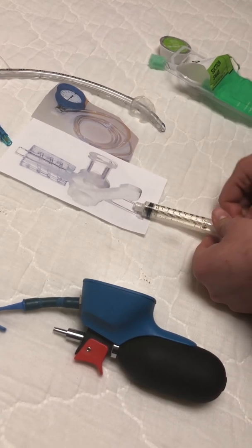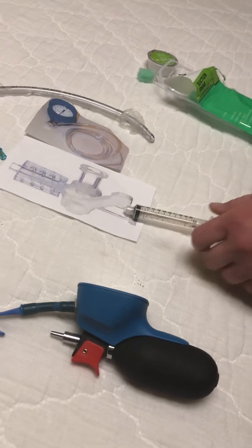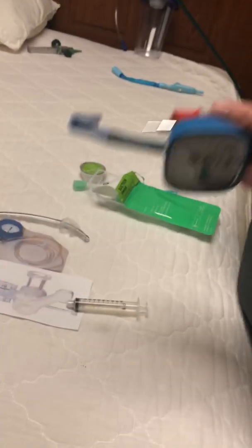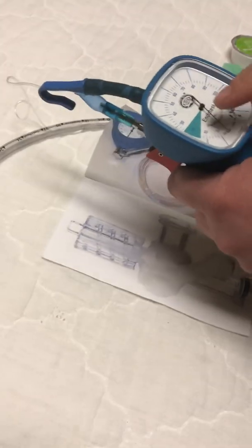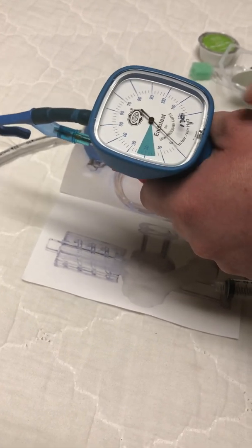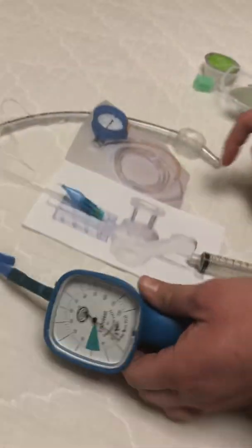And then the next thing that you're going to do is your occlusive technique. So for that one, you're going to start putting pressure into that patient's cuff until you hear that occluding point. And then when you're done with your minimal leak technique and everything, you're going to take another meter and connect it here, and make sure that it is at the appropriate area. So you want the 20 to 30. If it's too low, then you're going to increase that cuff pressure. And if it's too high, then you're going to use this little red button here, and it's going to release that pressure. So that way you know you have the appropriate pressure.